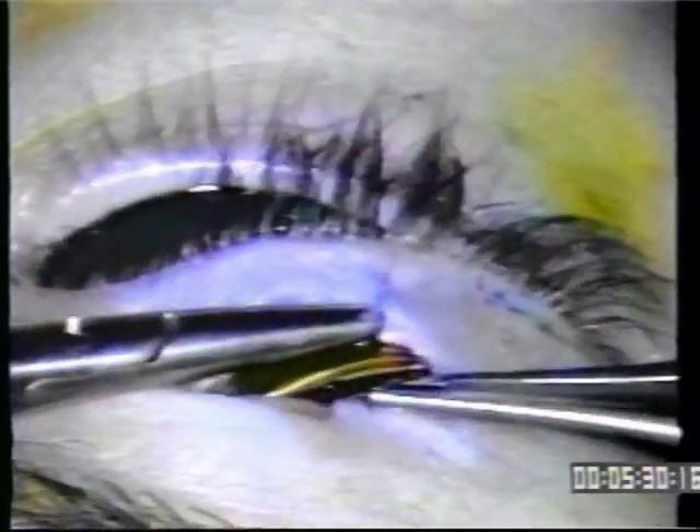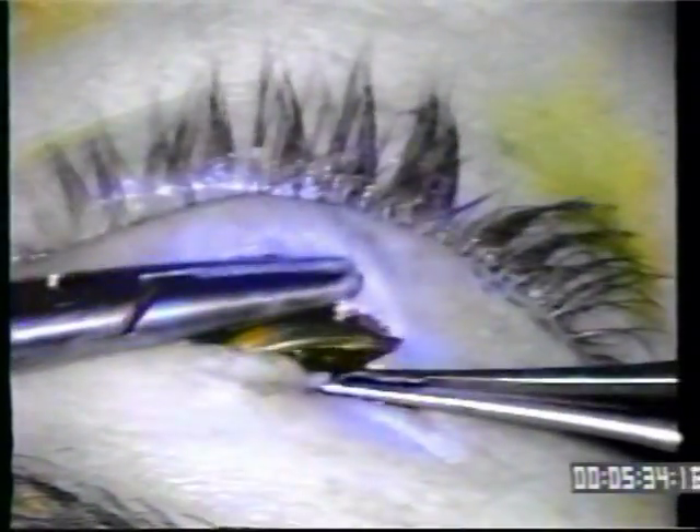Now we've fixed the gold inferiorly. The superior fixation is again through the hole, through the orbital septum, and then out — with five throws on the top suture. A suture is placed on the third hole as well, so that the gold will be completely fixed from three millimeters above the lash line inferiorly to the orbital septum superiorly. Once that's completed, the wound will be closed in layers.